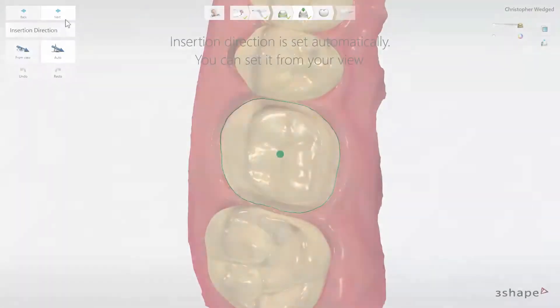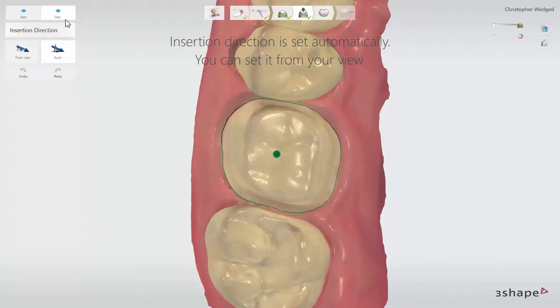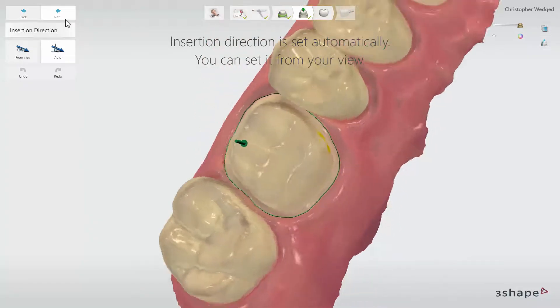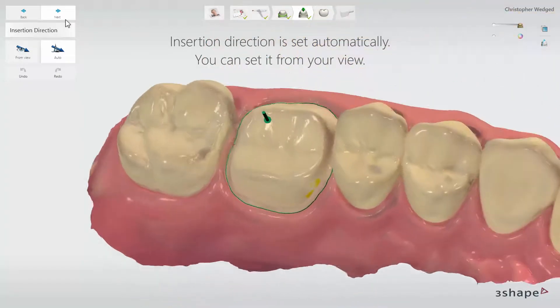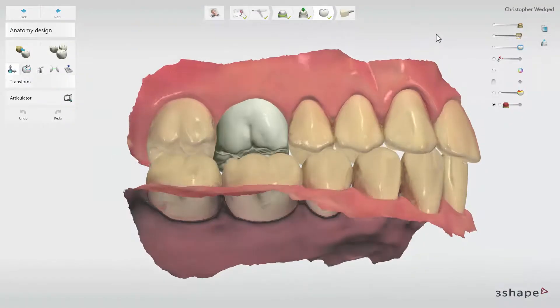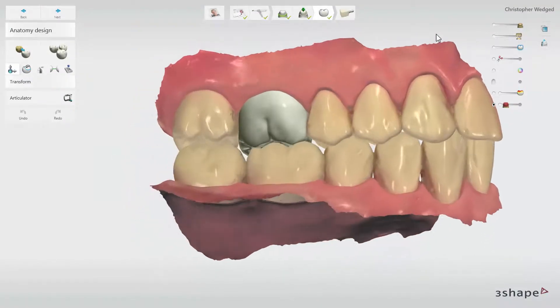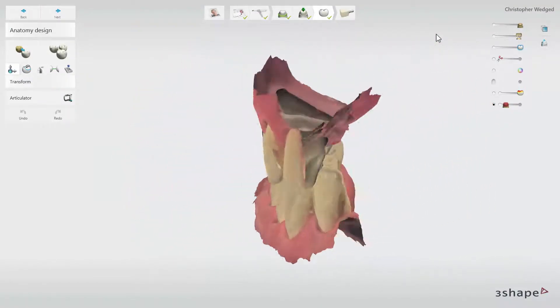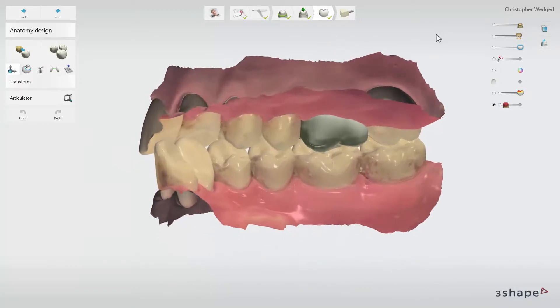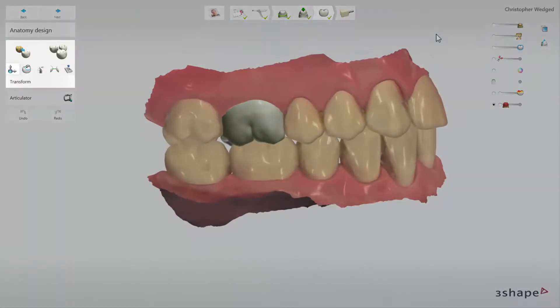The next step is Insertion Direction, which is automatically detected and has an optimal suggestion. Then go to the Anatomy Design step, where automatic placement creates a valid design. You can always perform some adjustments using the designing tools.